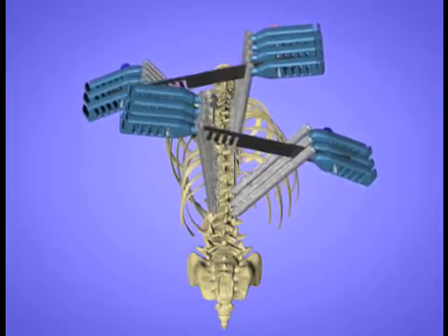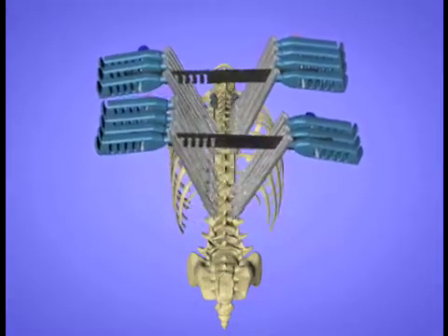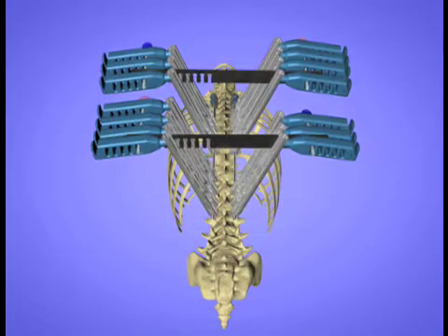The two curves are slowly derotated simultaneously by rotating the derotators in opposing directions over approximately 15 seconds.